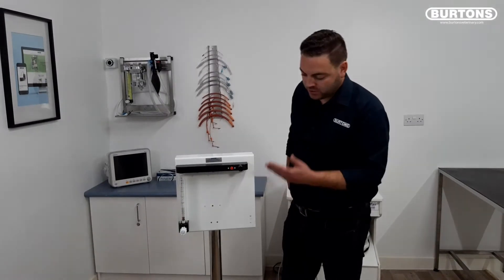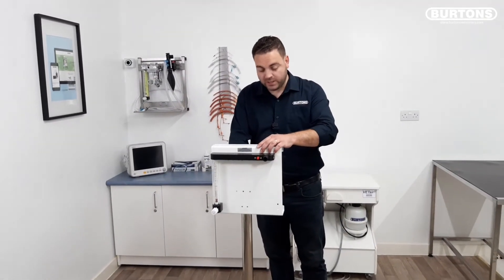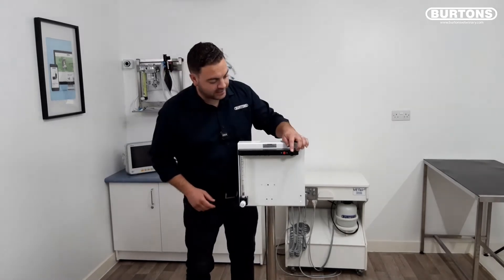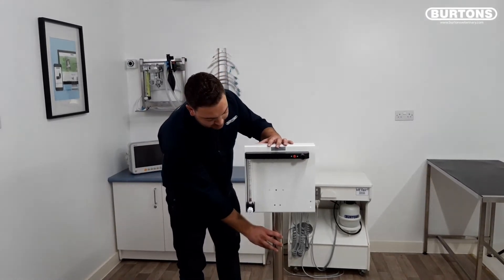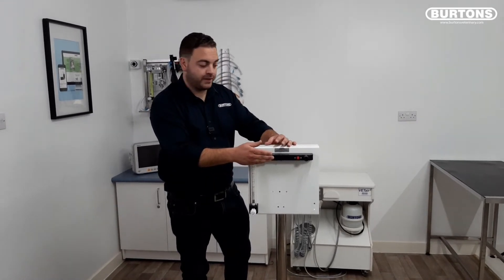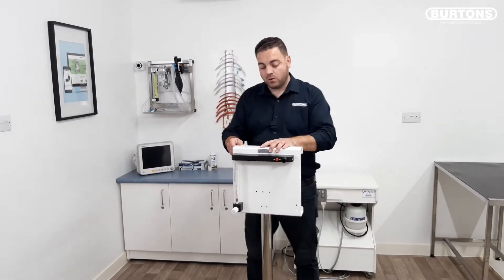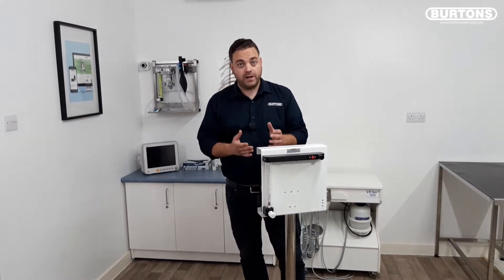Next we have the Burtons Solitaire system. This is our smallest trolley — very small and easy to manoeuvre. The machine comes specified as standard with the high accuracy rotameter unit and corner flush with pressure release valve. It can be specified with an additional vaporizer, either isoflurane or sevoflurane, and also with a pipeline lead to attach to pipe gas systems or with the additional cylinder pack for either E size or F size.